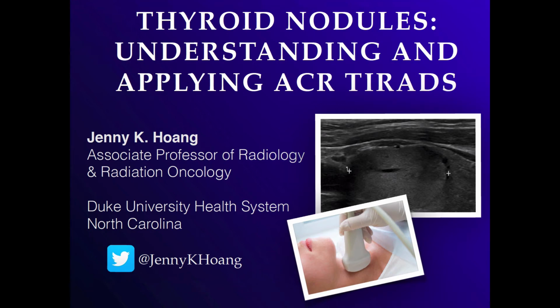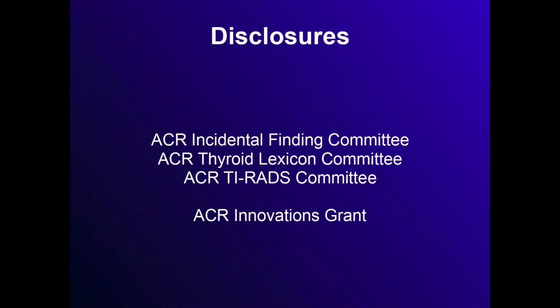Okay, so we are speaking about thyroid nodules on ultrasound and applying ACR TI-RADS to these thyroid ultrasounds. I speak from the point of view of being on 3 of the ACR's thyroid committees. I started off on the incidental findings committee as a neuroradiologist. These are incidental nodules that you see on imaging on CT and MRI.